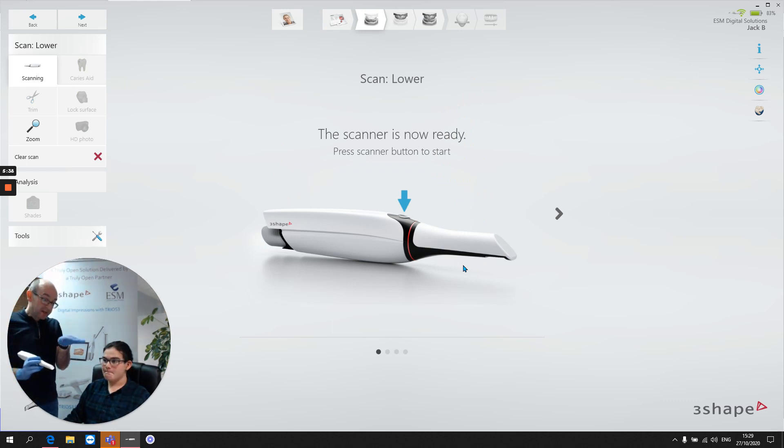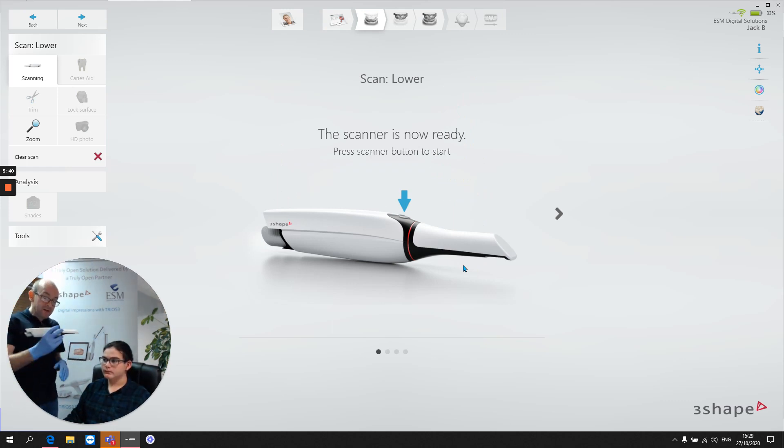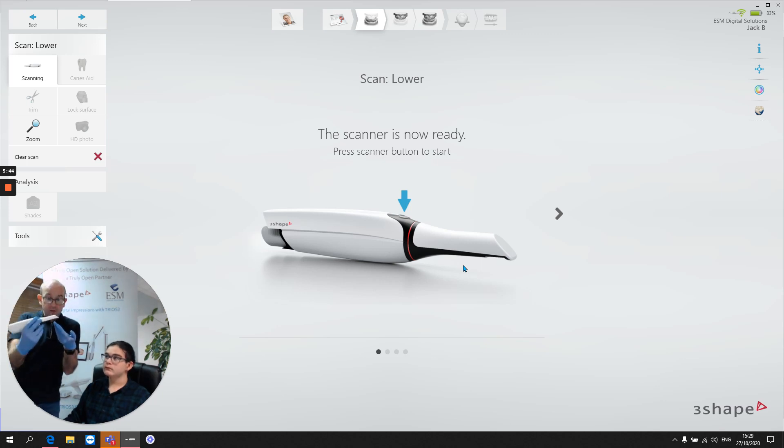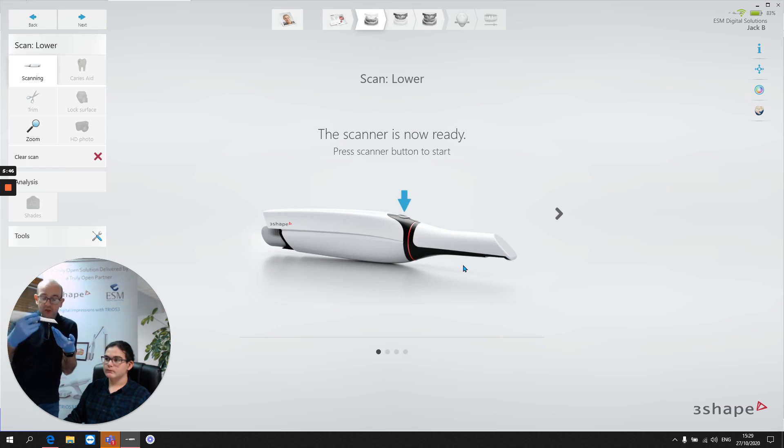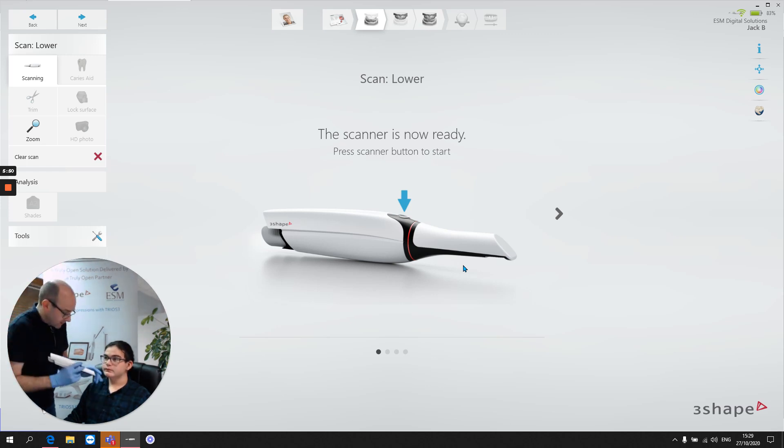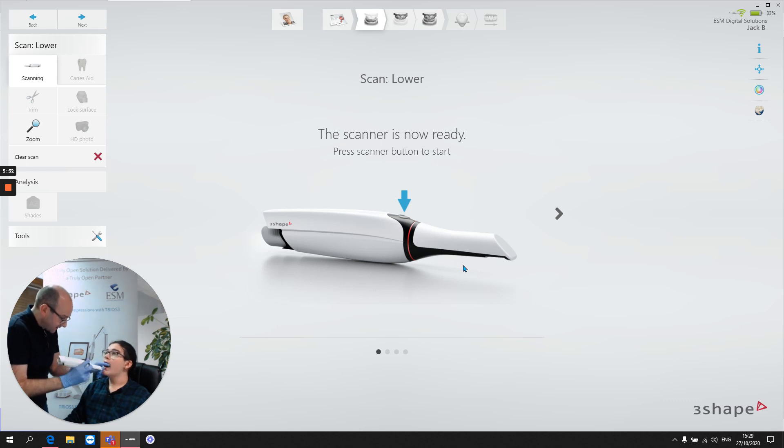So what the right way is, we do the occlusal scan and as we come around to the anterior region, just rock the scanner a little bit. So as we see those incisors, we're rocking the scanner just a little bit, just to capture a little bit of the buccal information. So let's do that again. Face towards me please, and head back and relax.